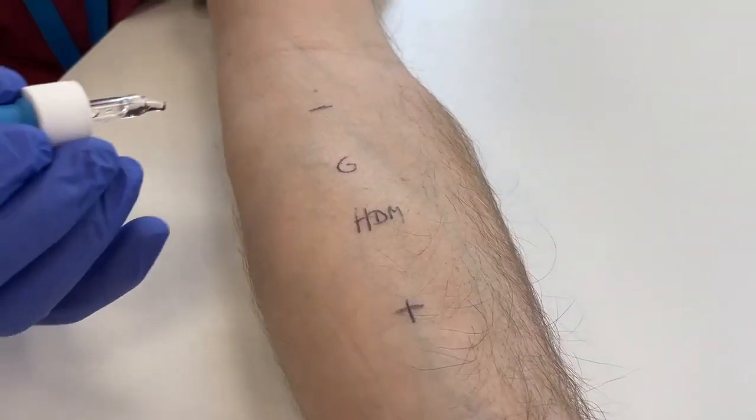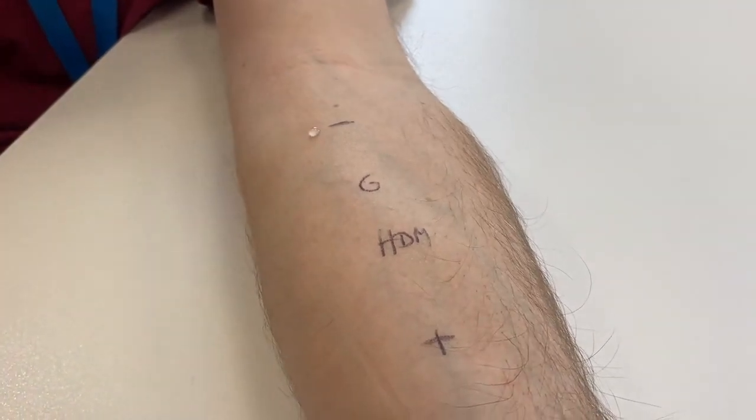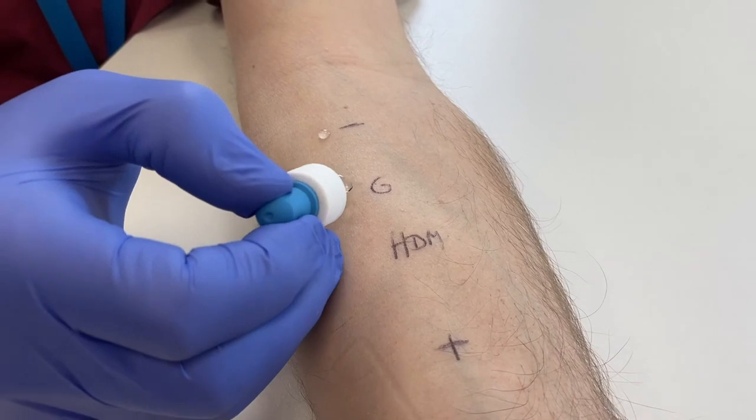One single drop of each allergen is carefully applied adjacent to the pen mark made previously. Be careful not to touch the dropper tip onto the skin.